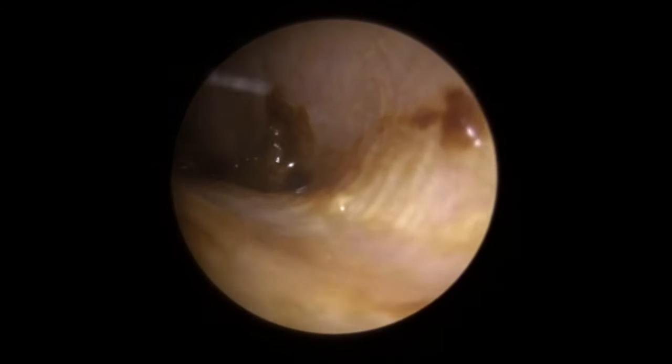There we are — so that's that little block there coming away. And if we look behind that now, you can see the eardrum there. That ear canal is looking a lot cleaner. When you look at the other side now, this gentleman hadn't put any oil in this side. So what we have here is lots of little different blocks of wax at the entrance here, all sitting really close to one another. So it looks a little bit easier to remove until we get a grip on it, and then you start to notice it's actually not moving very well at all. That's because there's a little ribbon of skin — you can just see it stretching and coming out of the ear canal, running down the left-hand side of this wax. Can't get a good enough grip to pull it out, so it's kind of concertinaed up in there.